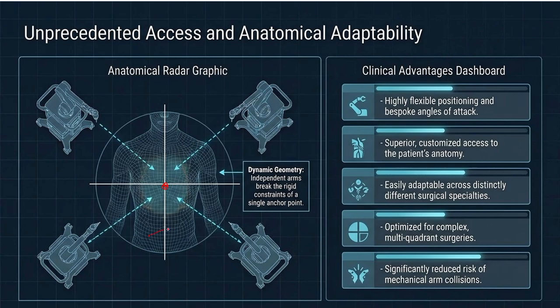When it comes to the pelvic region, some robotic surgical systems come with forward docking, and some come with reverse docking. In reverse docking the principle is the same. All four arms come from here, one, two, three, four. Some companies have one arm cart marked C for the camera, a dedicated arm cart for the camera.